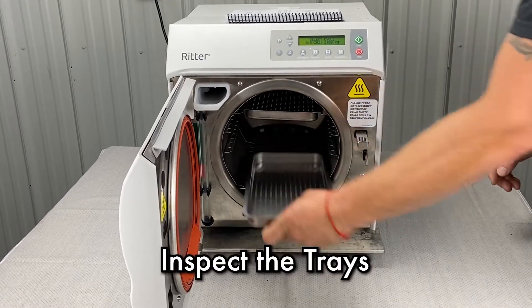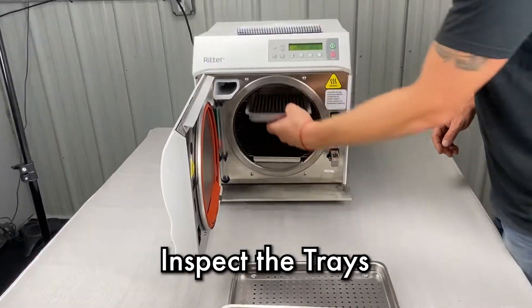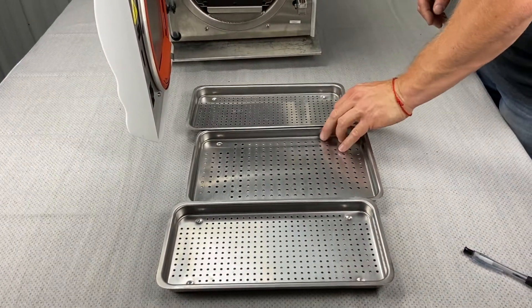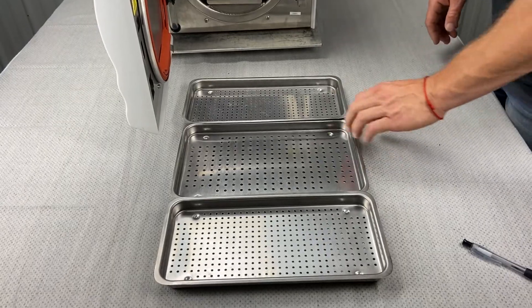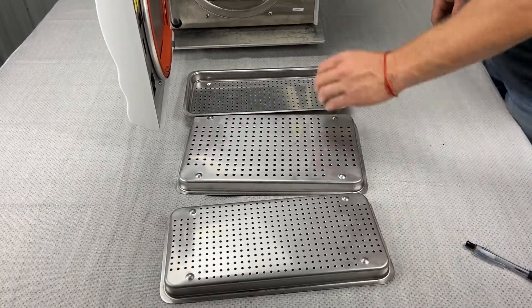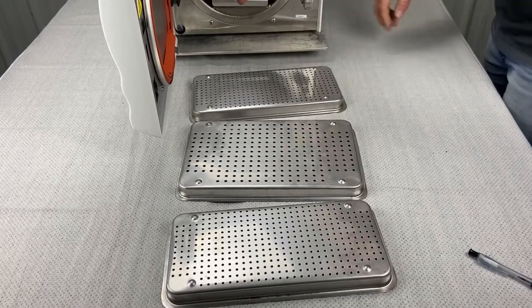We're going to look at the trays and make sure nothing's on them. Make sure they're all nice and clean, free of rubber, paper, needle tips — anything and everything that could get left behind on trays. Make sure they're all fairly clean.